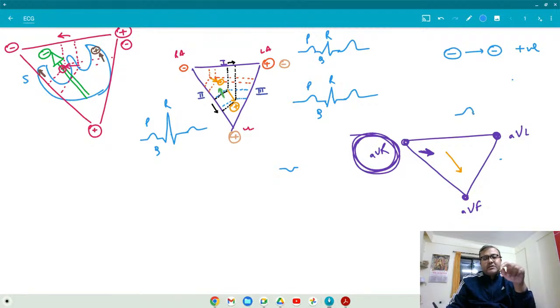Now, suppose it is towards the foot, this time let's talk about the foot. AVF.